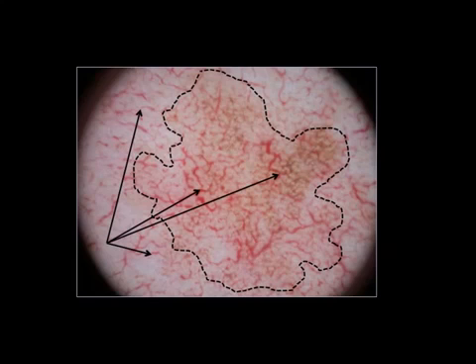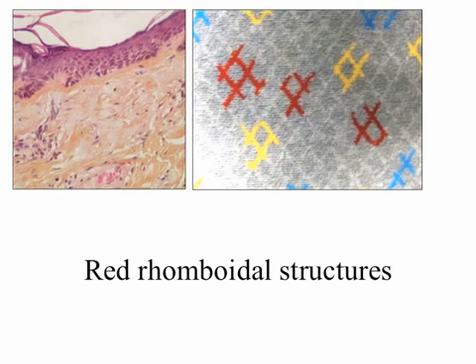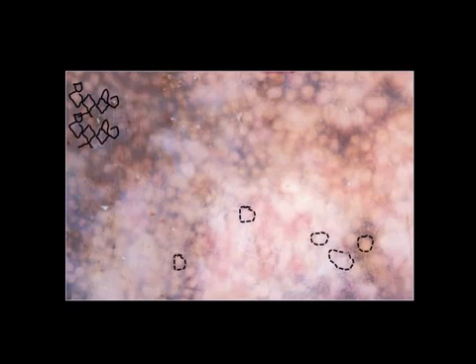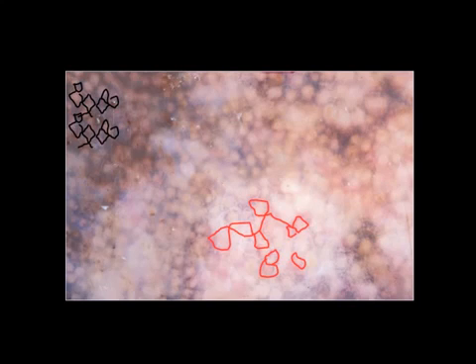Red rhomboidal structures: we are very used, after the work of Schiffner and co-workers, to recognize black rhomboidal structures, but red rhomboidal structures are also present and are due to blood vessels. If you look carefully, you have red lozenge-shaped structures — these red rhomboidal structures. You can see in this image both annular granular structures and also red rhomboidal structures.